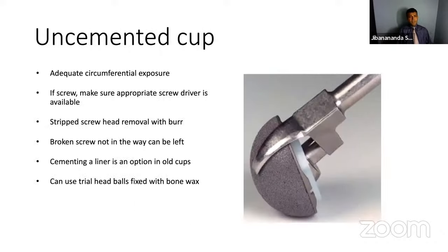Uncemented cup. How to remove an uncemented cup. Many of you will be very familiar with the Explant system from Zimmer. We use it almost every case. This has changed how you do revisions. Certainly a must-have tool for removal of an uncemented cup.